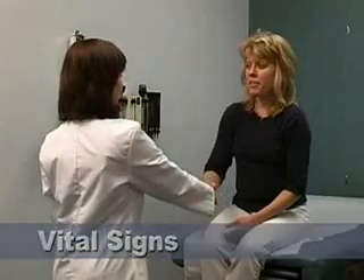Vital Signs. Position the patient properly. Confirm that the patient has not consumed food, alcohol, tobacco, or caffeine, or exercised in the last 30 minutes.